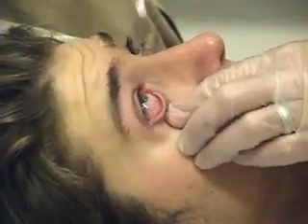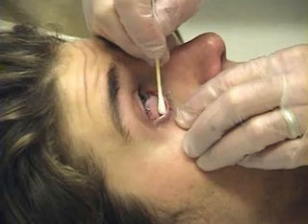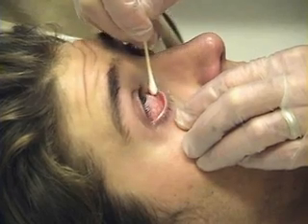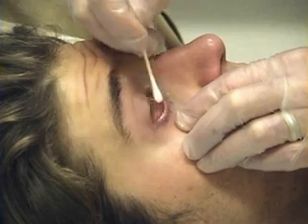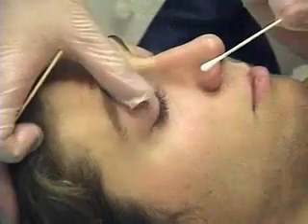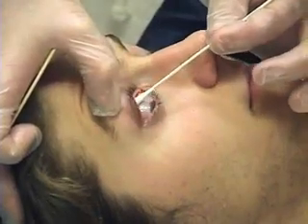Instruct the patient to keep his eye closed after the application in order to retain the medication. If there is suspicion of particulate matter in the eye, sweep it out with a moistened cotton-tipped applicator prior to irrigation. Both the inferior and superior fornices should be swept.